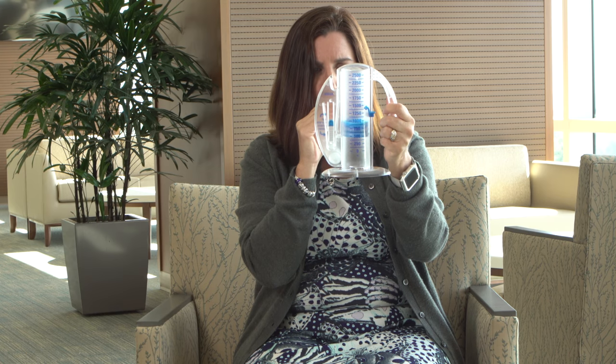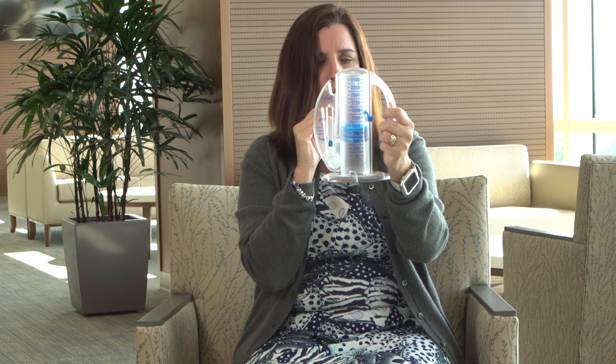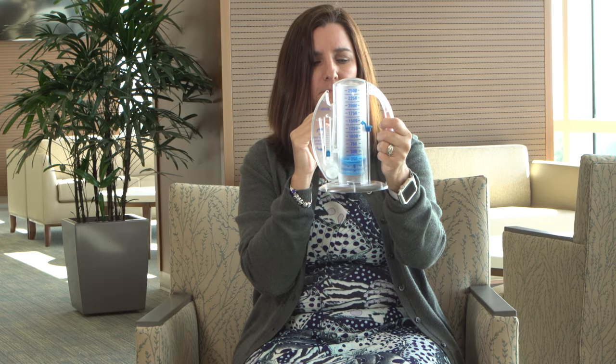Do not get discouraged if you do not reach the same number as before surgery. You will improve as you heal.